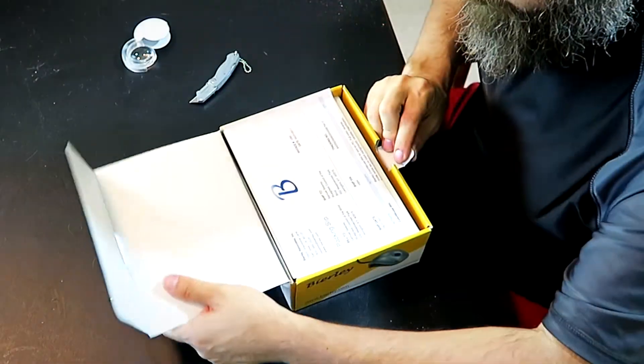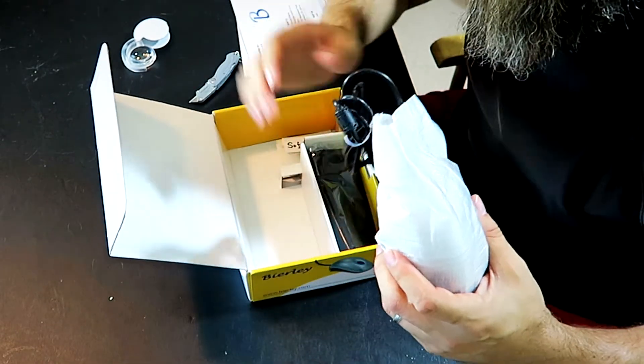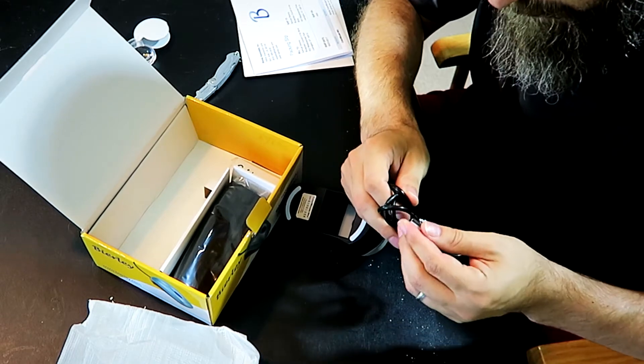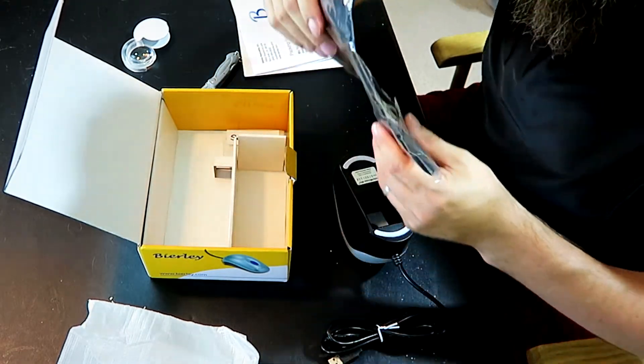They did a great job of packaging. So here we have an electronic magnifier by Beerly. This is the Color Mouse Mini. This is pretty cool. From what I understand, it's a CCTV built into a mouse, so you slide it across the surface of your book or your paper or whatever you're wanting to read. Here is the mouse and it connects by USB. And there's a little carrying case for it here.